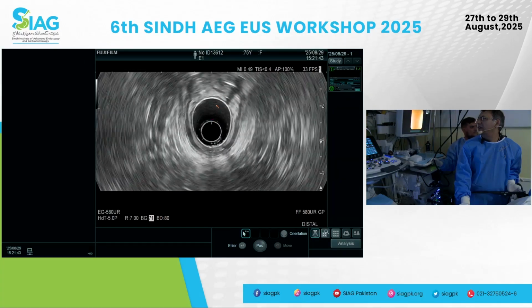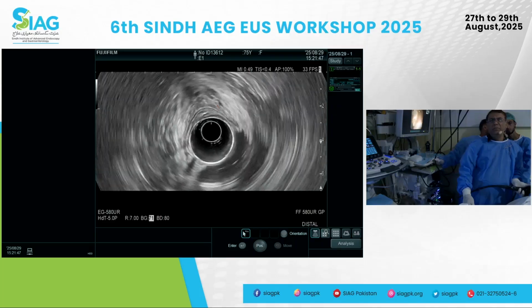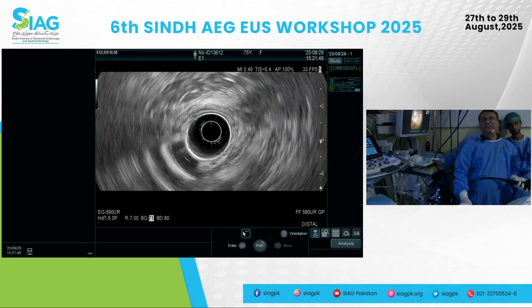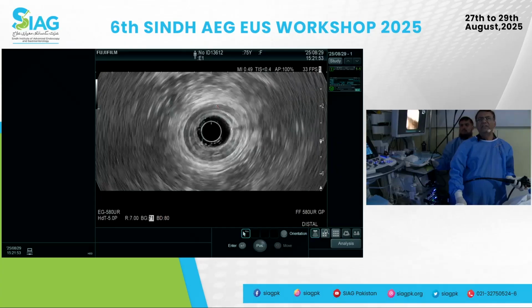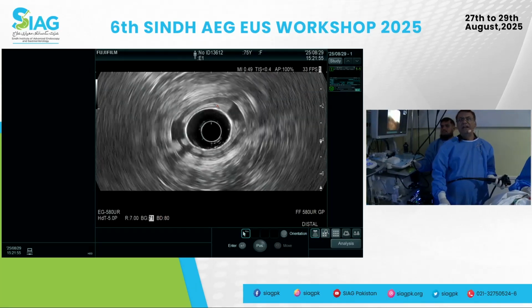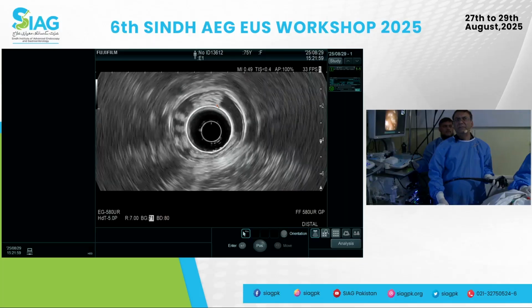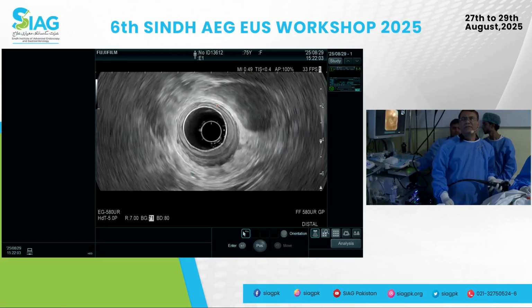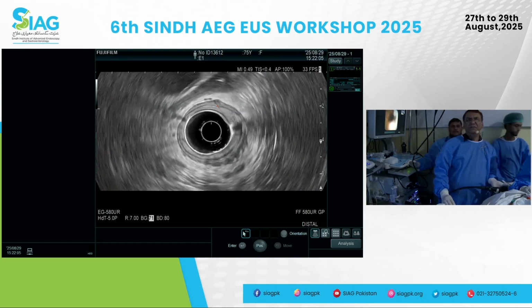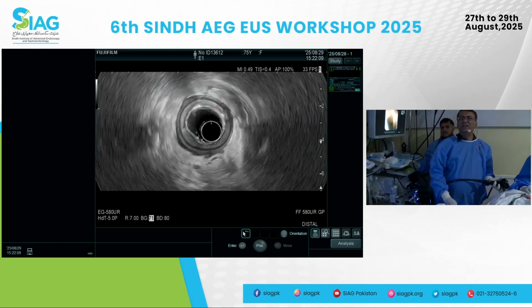I don't see anything. We're getting close to the distal area, so I'll go back and look for that rectal ulcer, put the probe right on there and see if I find any wall thickness. Right there, we don't see a mass.